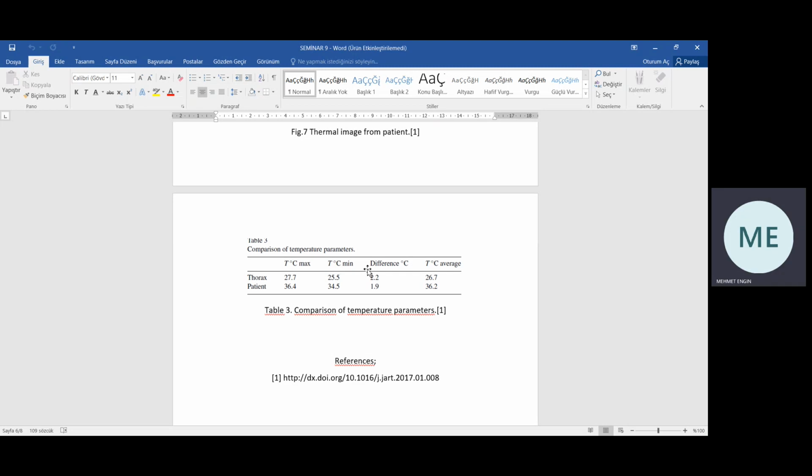But medical training for image interpretation is based on clinical case studies and analysis, which require a great amount of time and resources. In consequence, the proposed simulation device, or simulator, allows health professionals to become familiar with the imaging process and thermographic data interpretation.